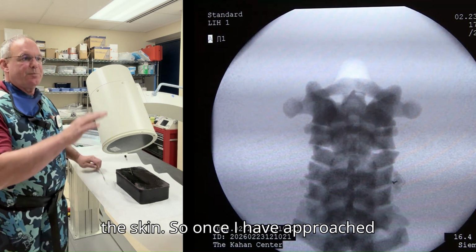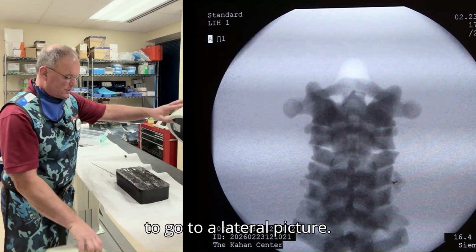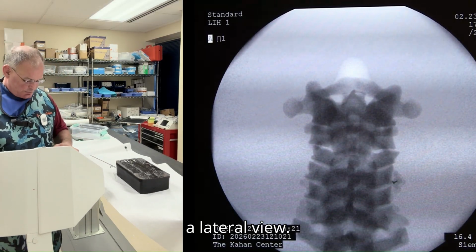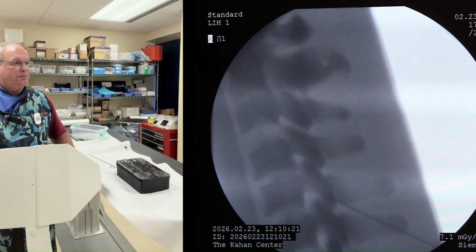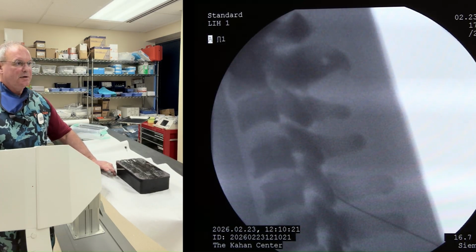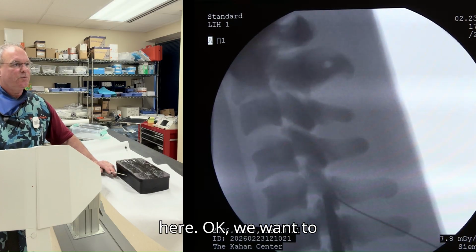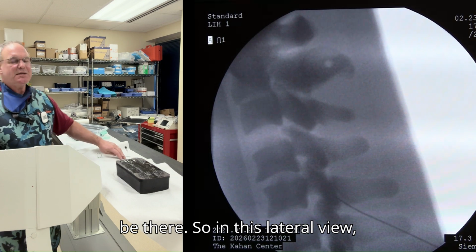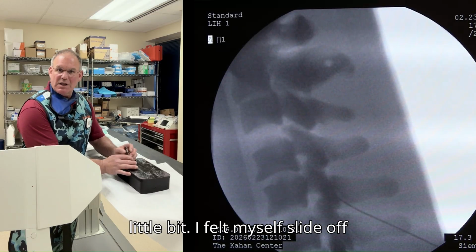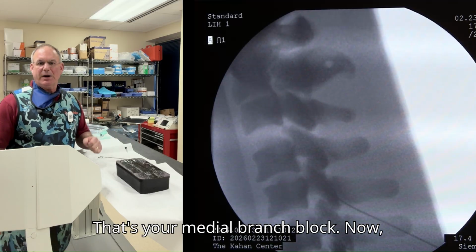So once I've approached that lateral mass there, I'm then going to go to a lateral picture and I'm going to adjust my depth in a lateral view. And as you can see, the needle tip is sitting right here. We want to be there. So in this lateral view, I'm just going to advance it a little bit. I felt myself slide off the bone, and I'm going to stop. That's your medial branch block.